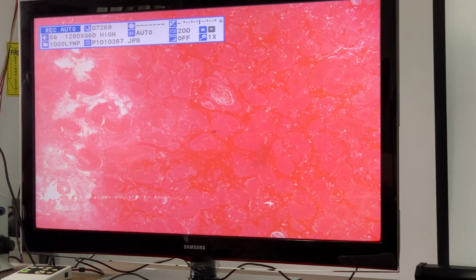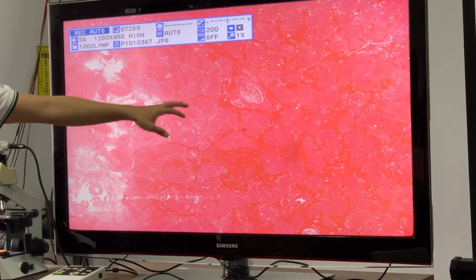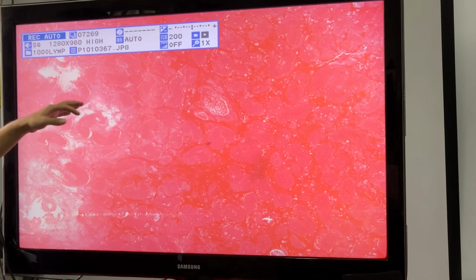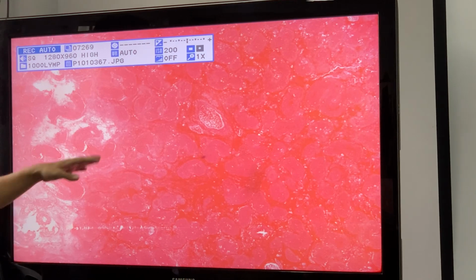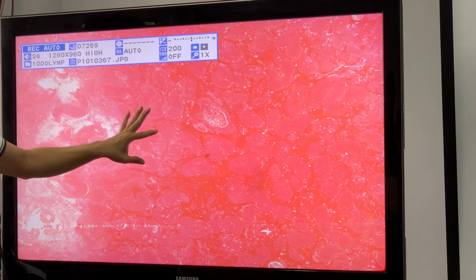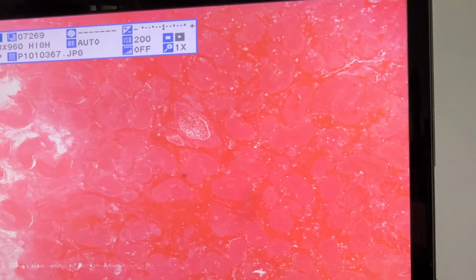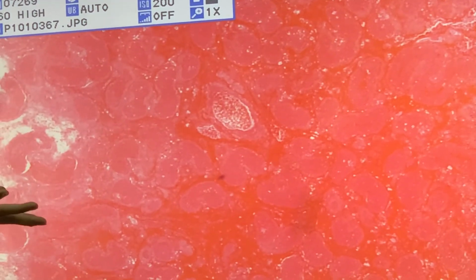Now, this is something interesting. Usually when I show this, there's only a few cells that show up. This is unexpected. Okay. The cells here are red. There's no nucleus, it's really pink. But you see that it's still maintaining its architecture. What type of necrosis is this? Coagulative. Now this is actually a testis.